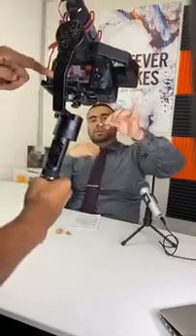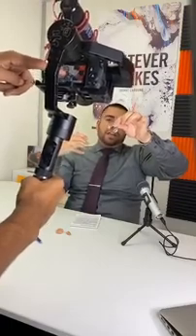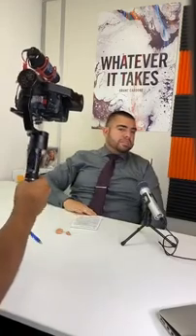So let's go over the receiver in the canal behind the ear. The hearing aid sits behind your ear, with a little wire that goes down into your canal with a soft dome. This little dome is made out of a special medical grade silicone that goes inside your ear. It's very flexible, very soft, really comfortable, and for the most comfortable hearing aid, I would definitely go with this. I can even put it on just to show you how it looks. The little tip goes inside your ear, the hearing aid goes behind. Just like that. You probably can't even see it.